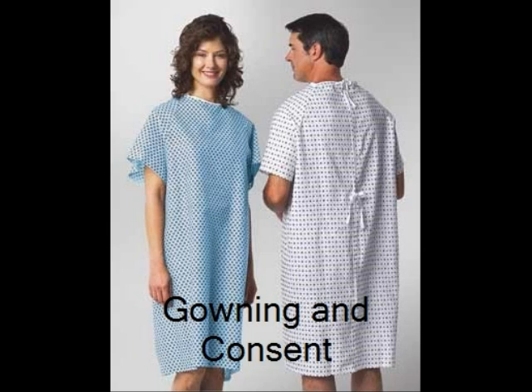Next, the patient should be placed in a gown. All clothing should be removed and the gown placed open to the back. Only socks can be left on, and underwear if there is no thick elastic, metallic parts, or glitter.